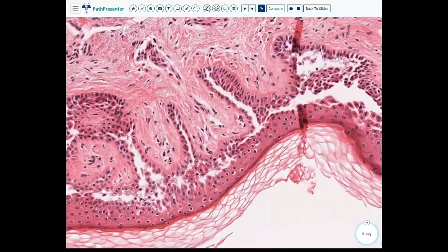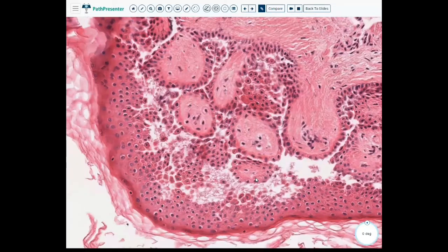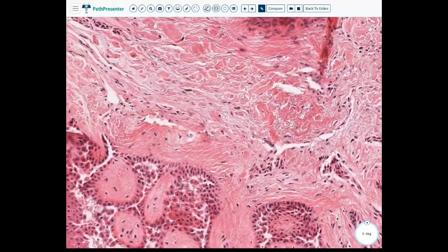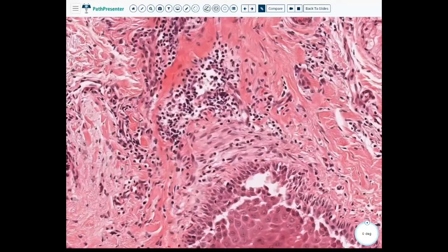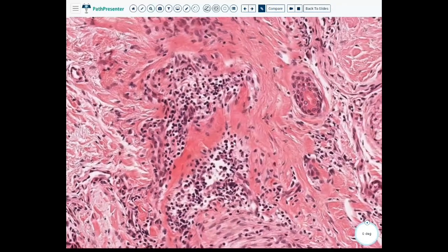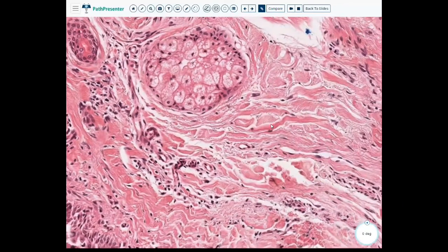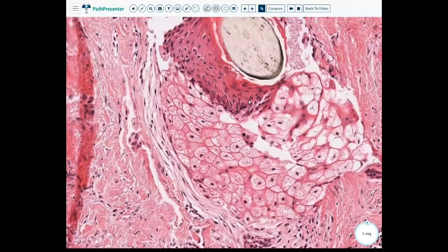You can see eosinophils as well within the dermis, but this looks mostly lymphocytic, which again is okay, because the direct immunofluorescence, or if you did the serum IgG or ELISA or C3 with this, remember, it has that sort of chicken wire pattern. And we can go back to that slide at the end of this just to briefly go over that again. So this is another case of pemphigus vulgaris.